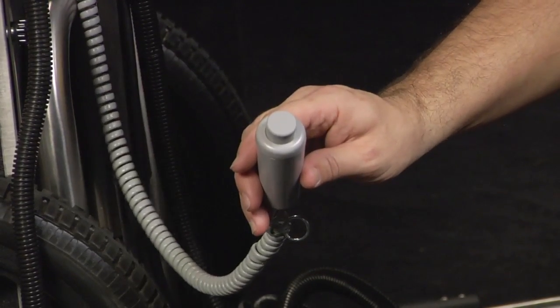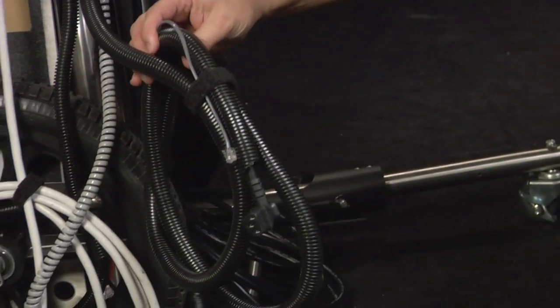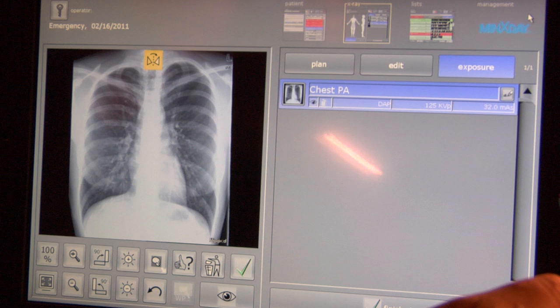Have the patient take a deep breath and hold it. Make the exposure when the green light on the bottom left of the exposure screen is on by pressing and holding the exposure switch until an audible beep is heard or transmitting as seen on the screen. Once the image is on the screen, select the green check mark under the image, then select chest LAT study.